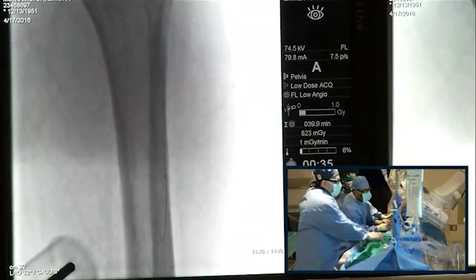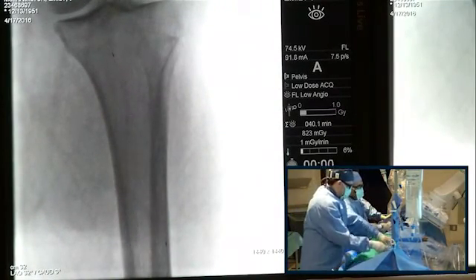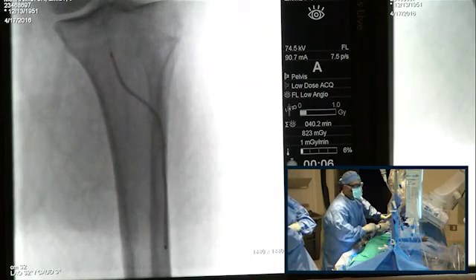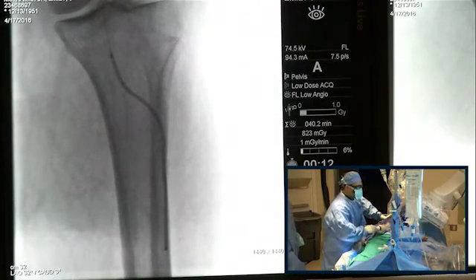Great work, by the way. Okay, that's good. Okay, so we can inflate down. And this is the balloon still? We changed it to a 2.5. So after this 2.5, we'll do the chocolate. But for the sake of time, I just kept this balloon so that at least I can show you the angiogram of the AT.